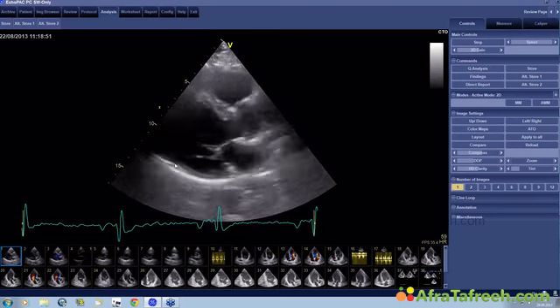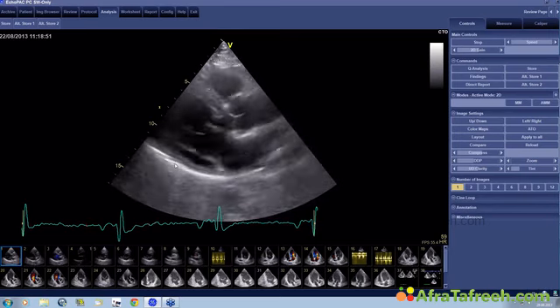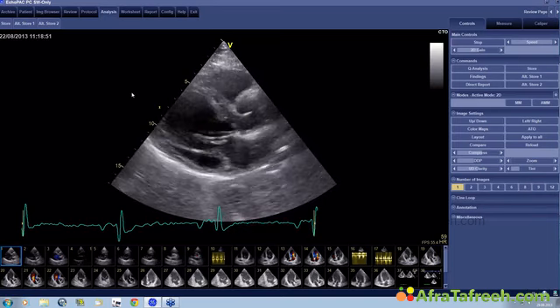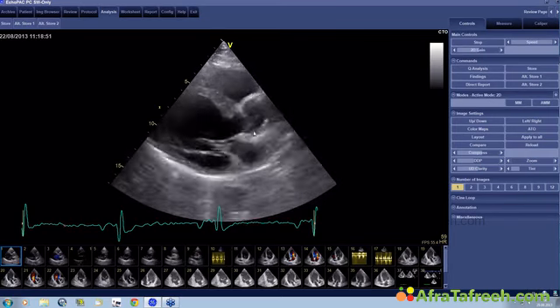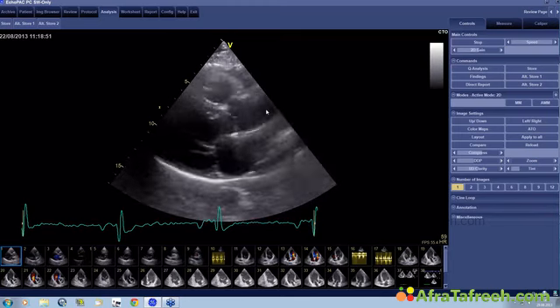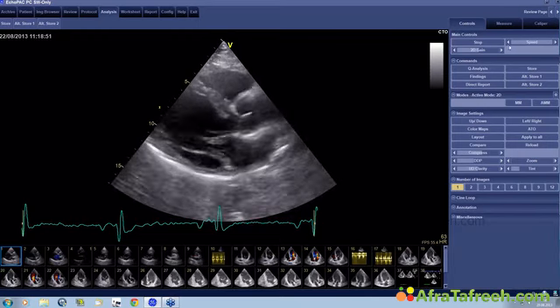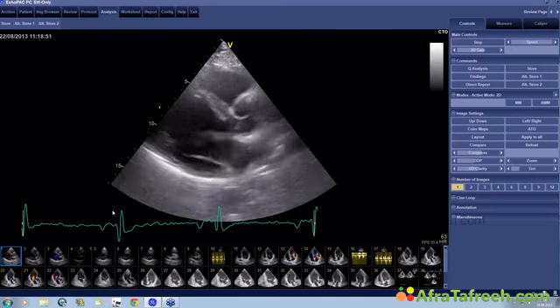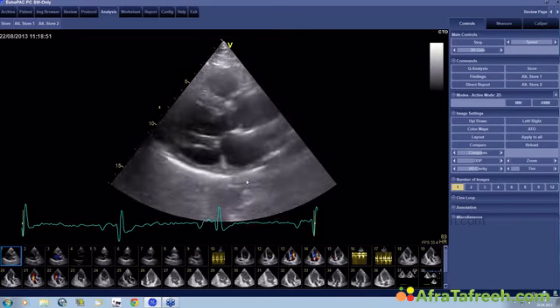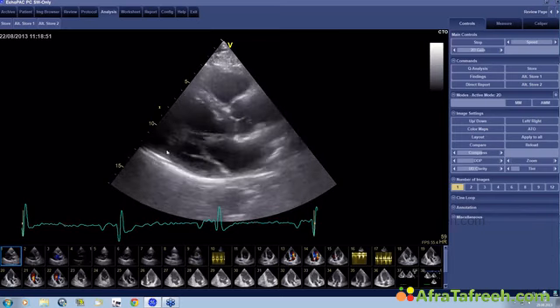First of all, when you look at patients who have coronary artery disease or where you suspect coronary artery disease, use as many views as possible. And you can even use the parasternal long axis view, because in this view you do see a number of segments which are very important. Right away, if you see this loop, the diagnosis should be clear. The patient has a problem right down here. The wall is thin, it's not moving, right? And this region is the posterolateral wall.